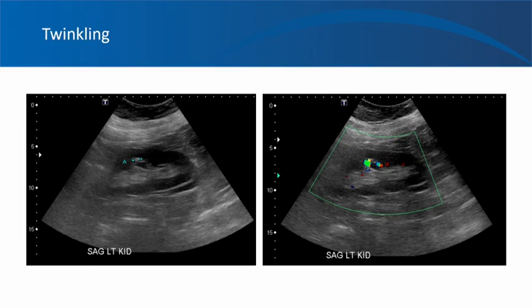In this kidney ultrasound, you see a hyperechoic structure in the upper pole of the kidney but there is no obvious shadowing, and you're not sure if it's sinus fat or a stone. On the color Doppler image, you see nice twinkling corresponding to this hyperechoic structure seen on grayscale imaging. Therefore, it is most likely a stone or calcified structure and less likely to be sinus fat.